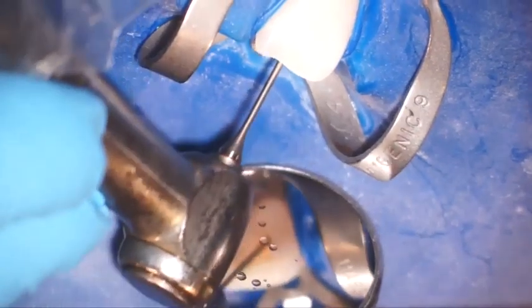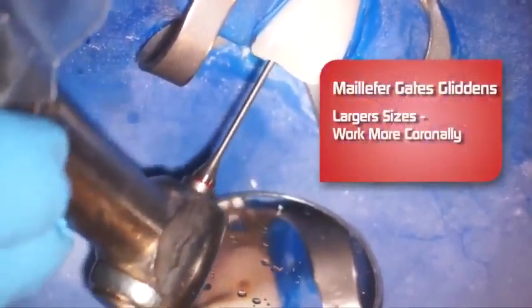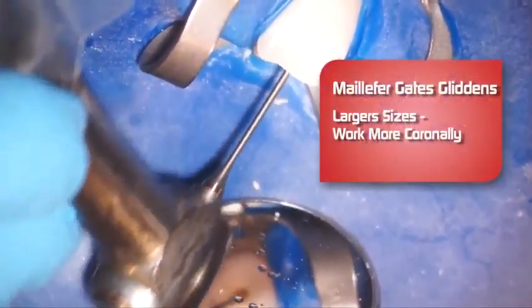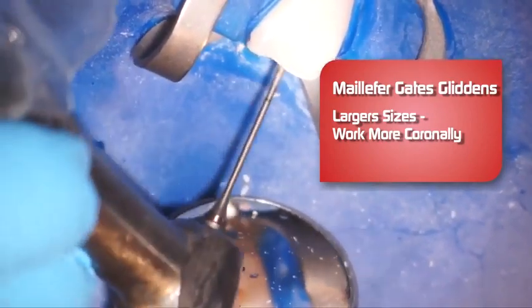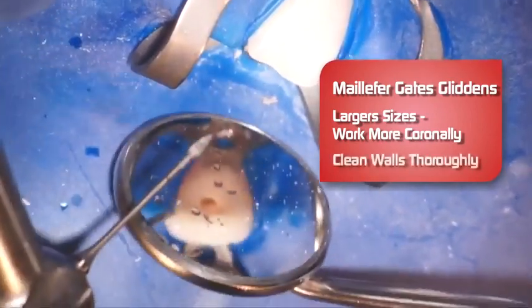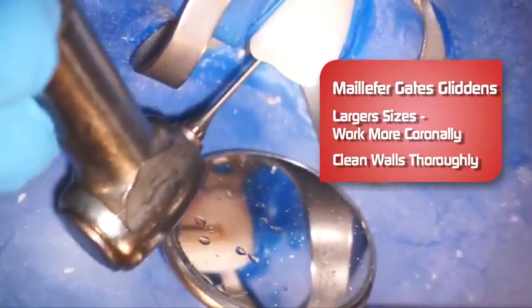Number three. And I'm using a number four Gates here. The larger you go up in size, the more coronally you're going to use it — you're not going to go as far into the canal. I'm really cleaning off these walls, making sure that there are no pulp horns left behind.